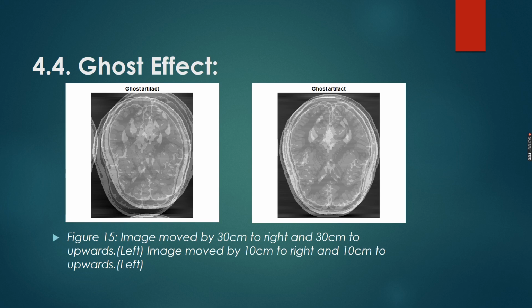Then we have ghost effect. On the left, we have image moved by 30 centimeters to the right and 30 centimeters upwards, and on the right, we have image moved by 10 centimeters to the right and 10 centimeters upwards.